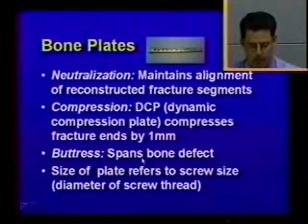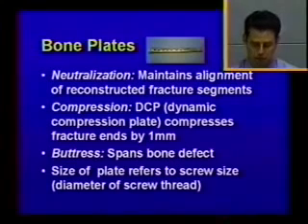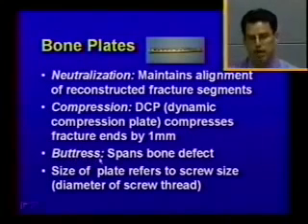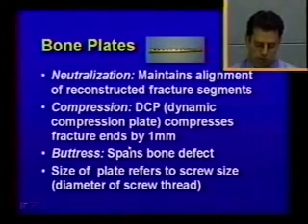Okay, bone plates are used in three different ways. They can be used as neutralization plates, and this is just to maintain the alignment of the reconstructed fragments. They can be used to compress fractures that are transverse and completely reconstructed. This is done with a dynamic compression plate or a DCP plate, and the degree of compression per screw that is compressed is going to be 1 millimeter. Also, plates can be used to buttress if we have a big bony defect, such as one after a highly comminuted fracture. We'll use a plate in buttress fashion, so the screws will only be engaging the proximal and distal portions of the bone that are still intact.